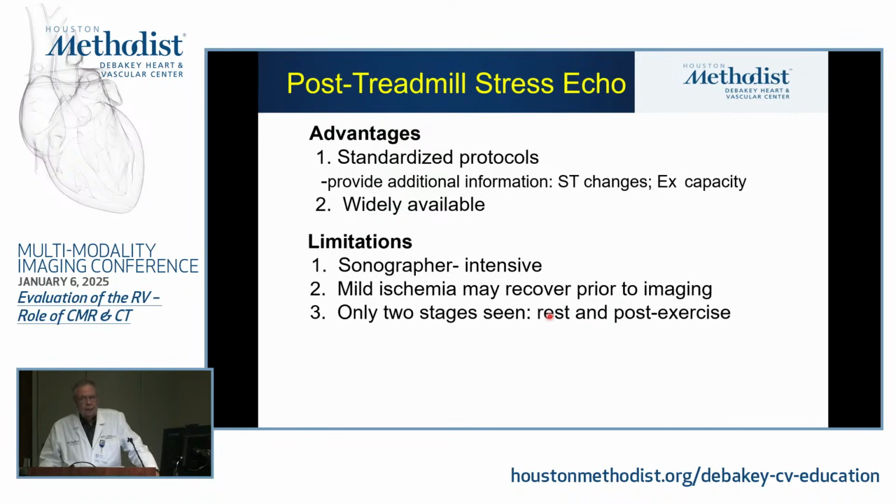So the post-treadmill technique, what are the advantages? It's a standardized protocol. A Bruce treadmill has been used for decades. Almost every office practice has a treadmill, and it's easy to do. Now, the limitation is that of all the stress echo modalities, this is the most challenging for the sonographer. It's quite sonographer intensive. This is not where you start your sonographer practice, learning how to do stress echoes, because it's very, very intense.